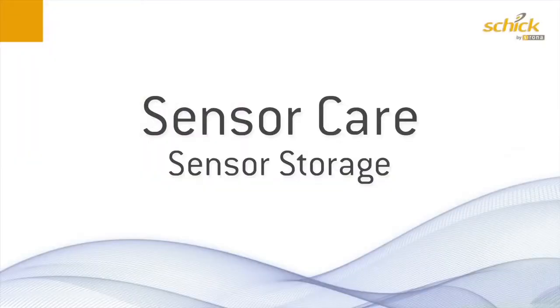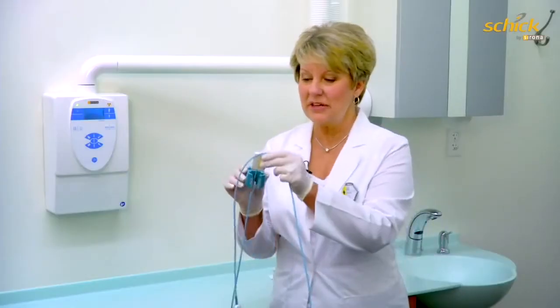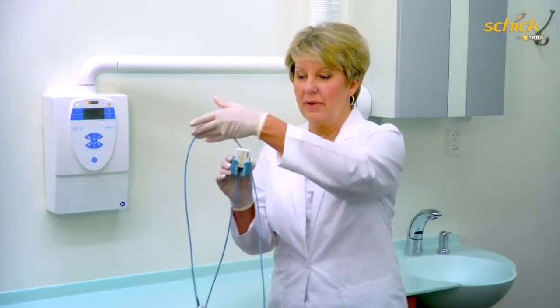A wall-mounted holster is always recommended to store your sensor in. Place the sensor into the holder and wrap the cable around it once to keep the cable from kinking or coiling.